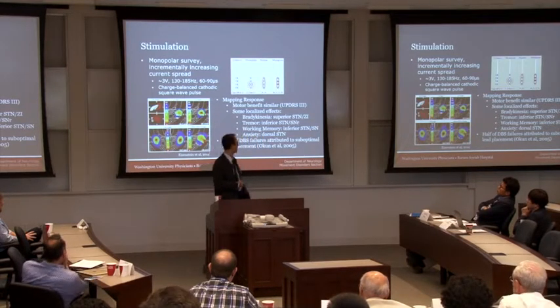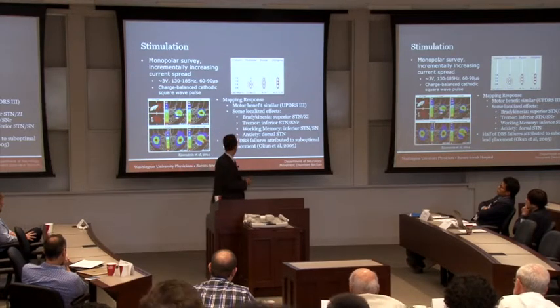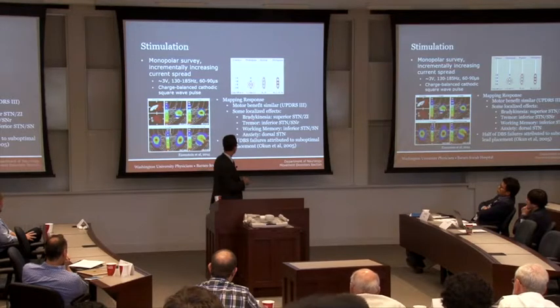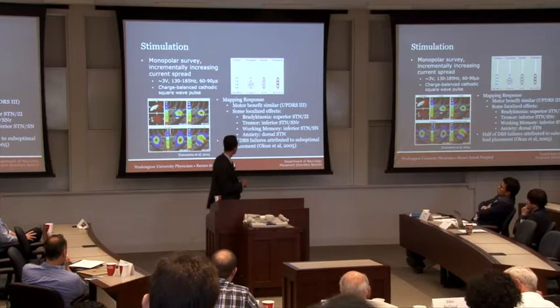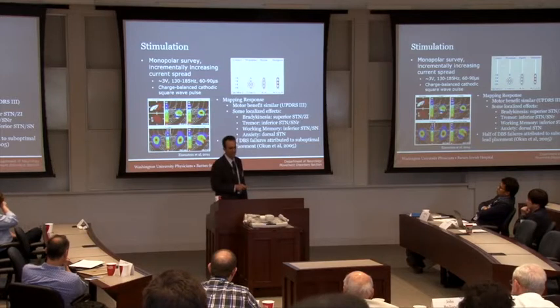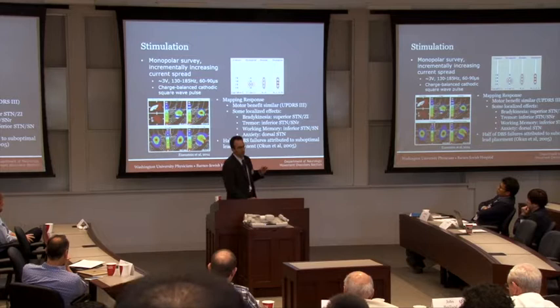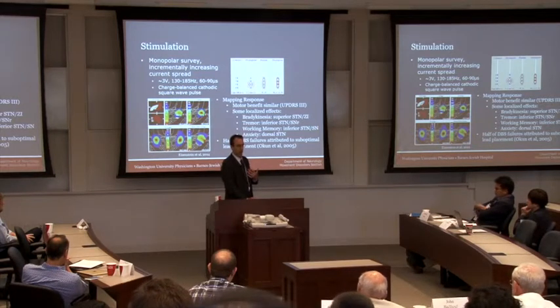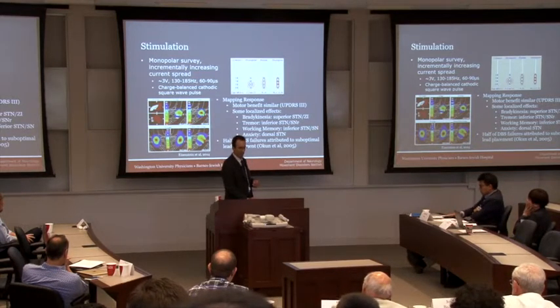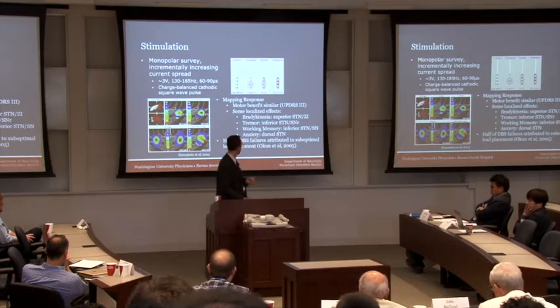However, there also seem to be localized effects, and I think this also is important in thinking about where these circuits are changing, breaking down, and how they affect that. And so bradykinesia seems to be in a more superior aspect of the STN, the tremor seems to be in a more inferior aspect, and then side effects we can see by stimulating various areas. Working memory can be affected, anxiety can result from stimulation. The important component for me as a clinician, but also thinking about these networks, is that DBS failures result from suboptimal lead placement, and that's been demonstrated previously and is an important concept.